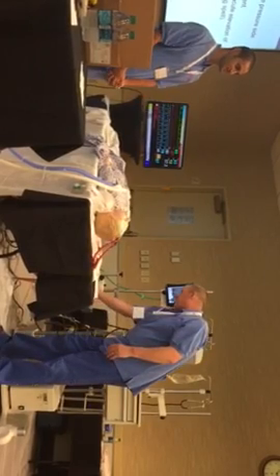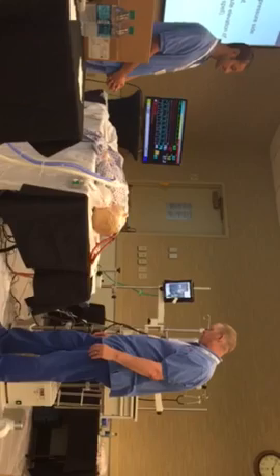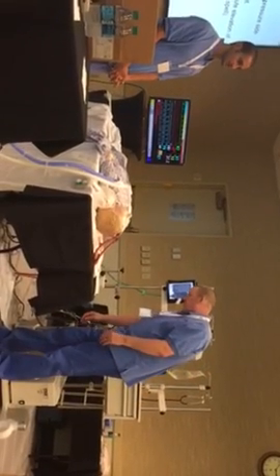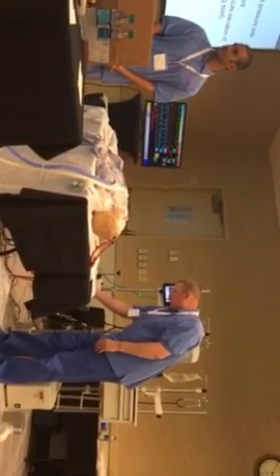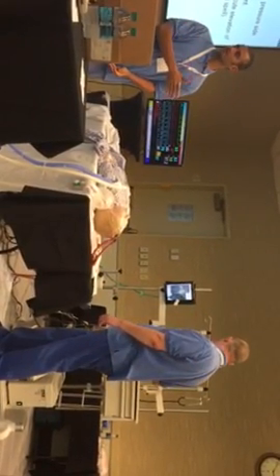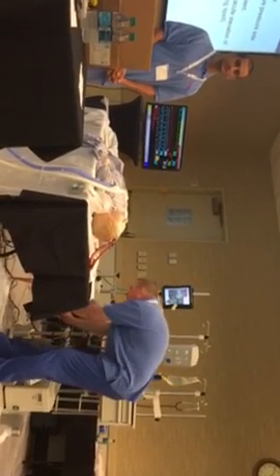And where is it on the pre-oxygenator side specifically, right? The nice thing about these oxygenators is they act as a large sink, and they can take a significant air bolus. Is it about 50 mLs that they can take before they go from pre to post? It's about speed too, right? So it's about how big is the bolus coming into the circuit.